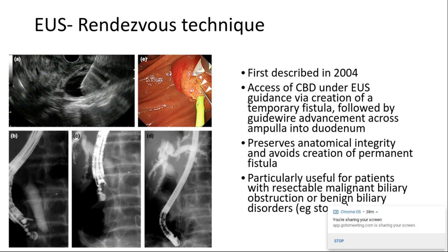Now, guide wire manipulation is the most challenging technical aspect of this procedure, as well as key to its success. Recent studies have shown that the extrahepatic bile duct approach from D2 is often able to minimize the challenges associated with guide wire manipulation and can improve the success rate. However, this approach isn't always feasible because it's often hard to get a good stable scope position.